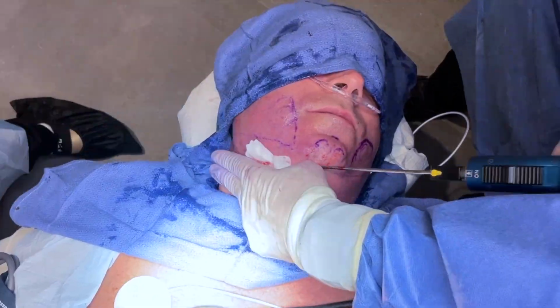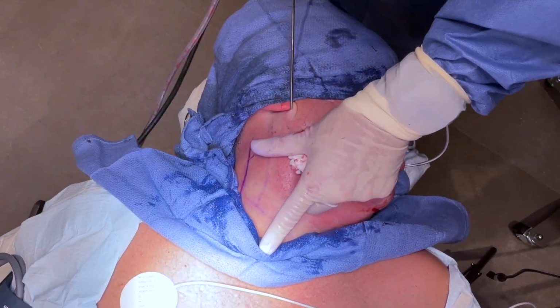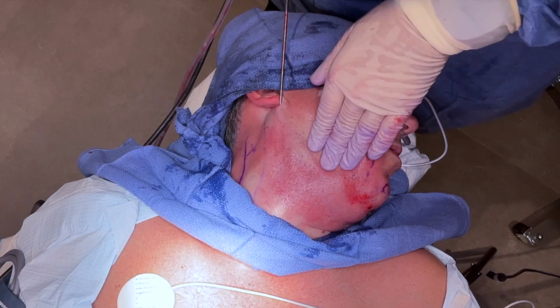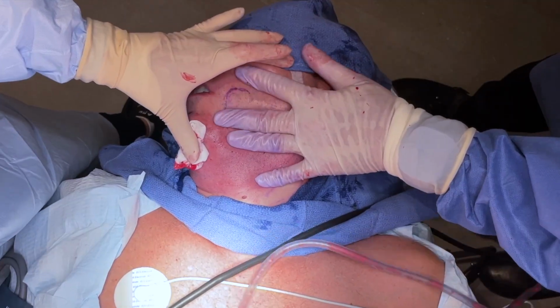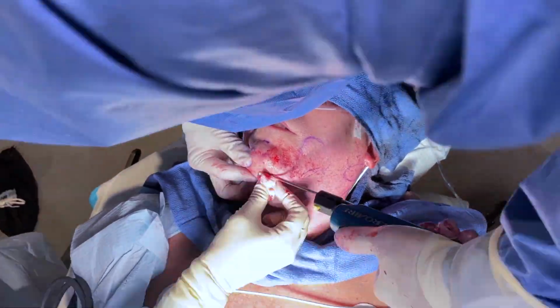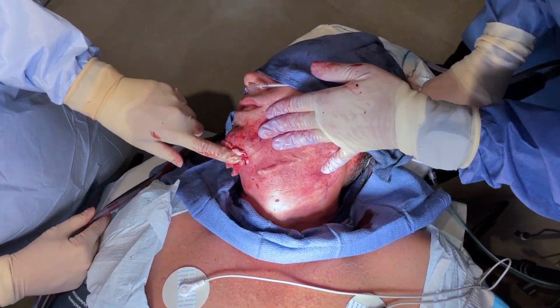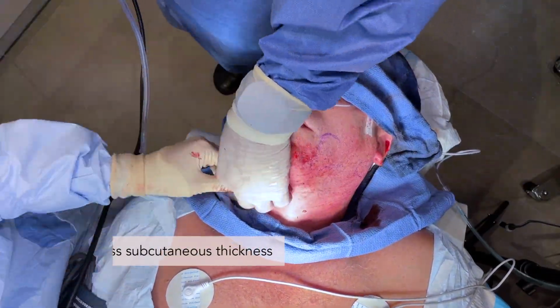As demonstrated in this video, the extent of suction is pretty wide. It is the jowl area, we do the submental area, any areas medial to the sternocleidomastoid muscle are treated, and we go all the way down to the sternal notch. And once the suction is completed, we're using our spatula in order to free up any remaining skin. This is our skin flap that is being freed up right now by our spatula. And again, the spatula is a very thin cannula, and the purpose of it is really making sure that the skin is released. And then finally, we do a pinch test to assess thickness.